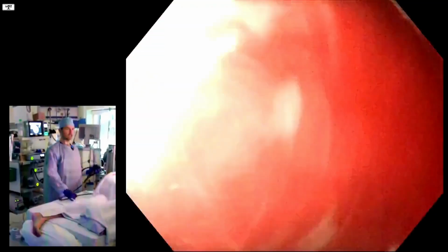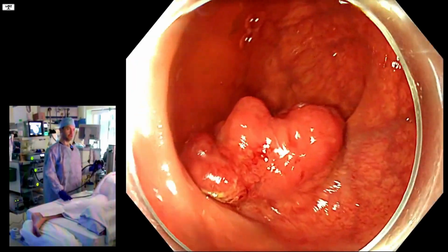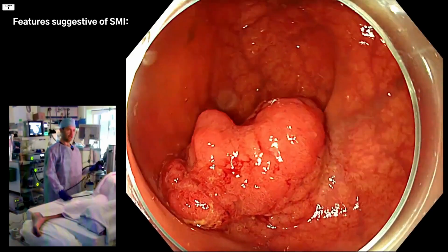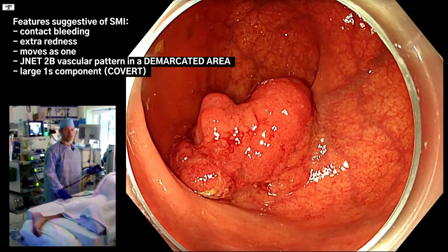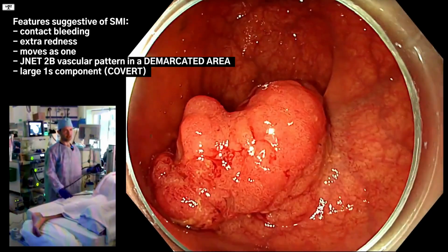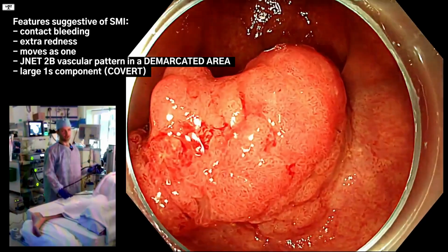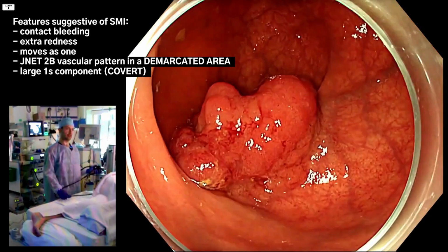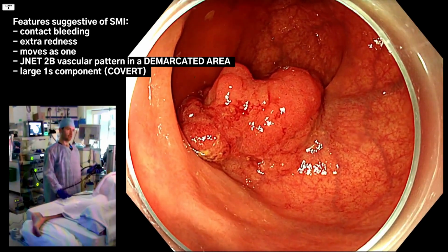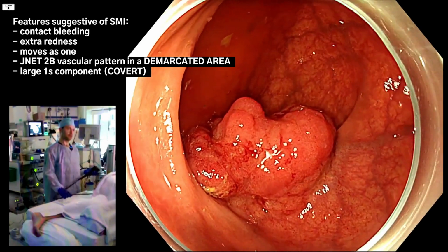So not only do we have here the surface characteristics of disordered pit pattern, certainly JNET 2B pit pattern, a regularly irregular pit pattern, but we also have contact bleeding, extra redness on the left-hand side, a demarcated area, and a very bulky lesion where we know that there could be submucosal invasive cancer buried underneath. This is your classic rectal covert polyp, and this is your classic potential malignant polyp in the rectum.